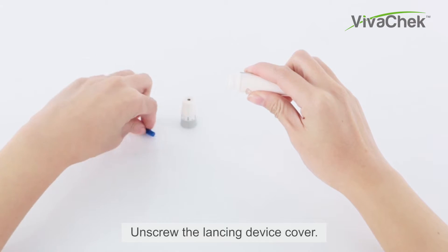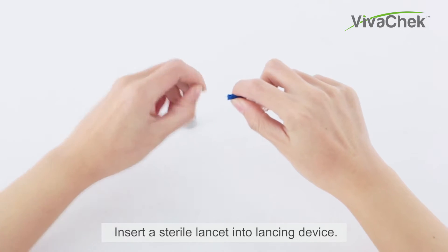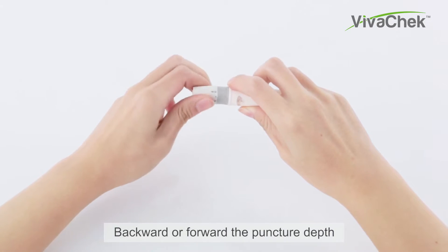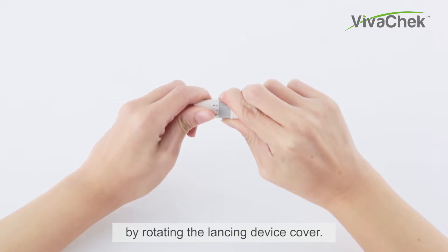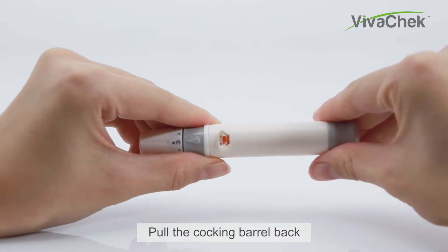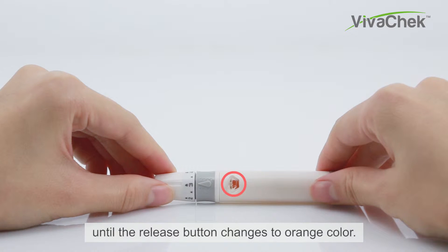Unscrew the lancing device cover and insert a sterile lancet into the lancing device. Twist the safety tab of the lancet, then carefully screw the cover back onto the lancing device. Adjust the puncture depth by rotating the lancing device cover — start from two or three.